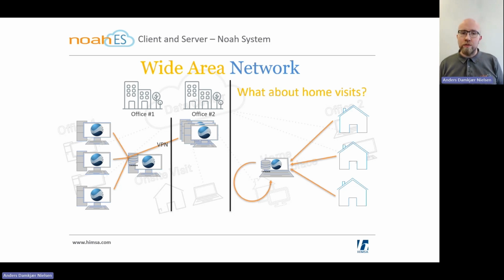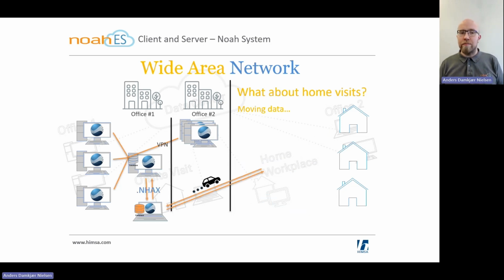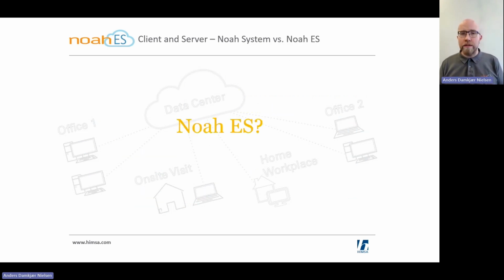This also means that to make sure you do that, you either need a VPN or you're going to need to actually move that laptop back and forth, take it into the office, perform these NHAX exports, import them into the main database, take the data you need back out into the laptop, and drive back out into the field. This is generally a lot of hassle. It's complicated. There's a lot of work in this, which is of course why I'm here today.